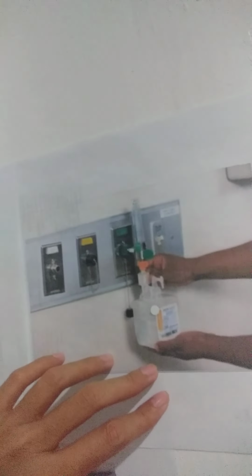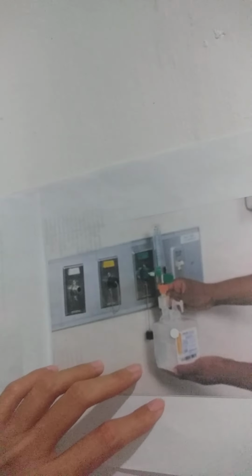And then we have to attach the tubing to the humidifier. You have to attach the tubing to the humidifier. This one.